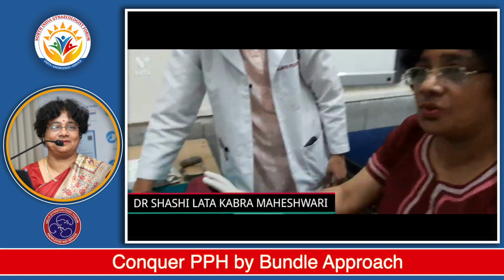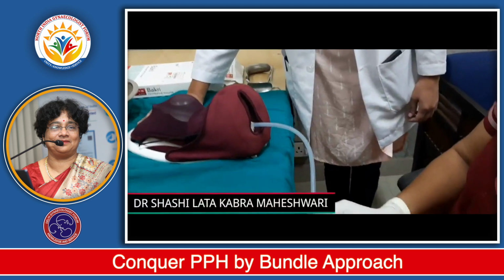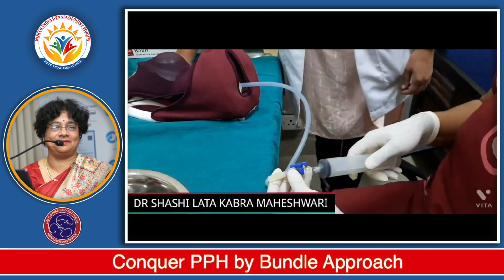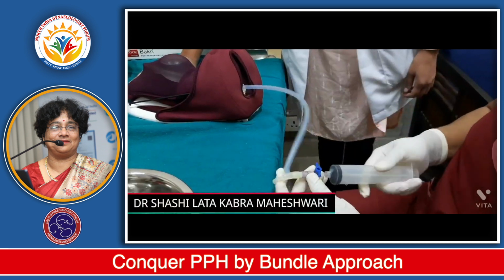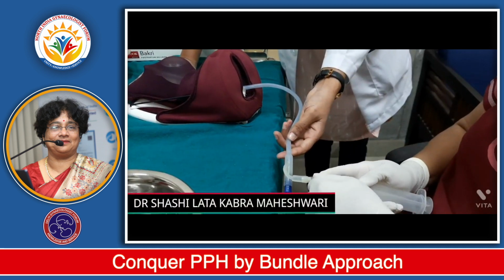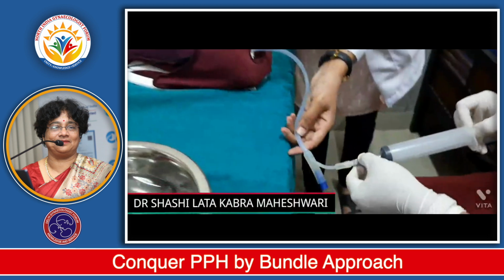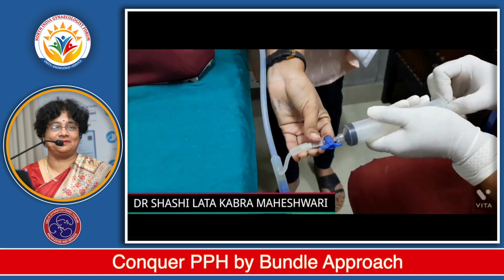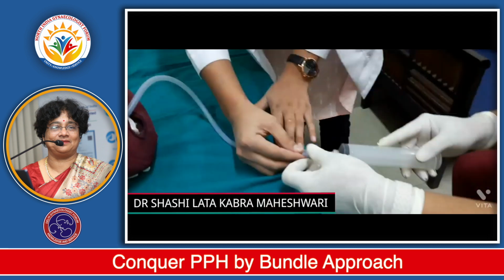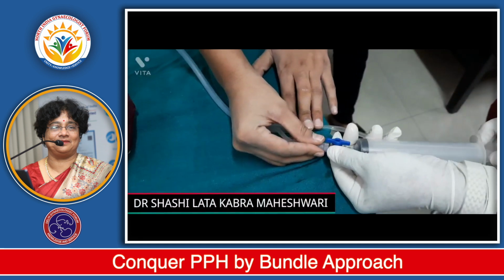So now I am showing you how to remove the catheter. So again I will take the 50 cc syringe, I will check for the vitals of the patient, and this I will open, make it open. So first I will attach the syringe, and I will make this open, and gradually, please help me hold this. For deflating, you have to again take a 50 cc syringe, and I will attach it with this end, and I will make it open, and then I will gradually start deflating.